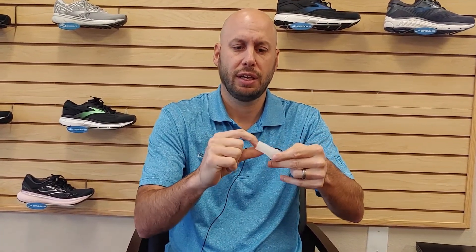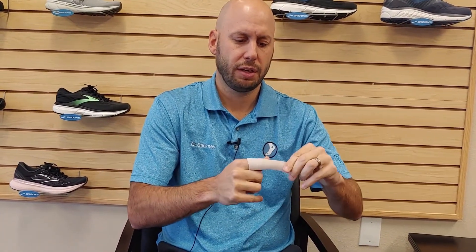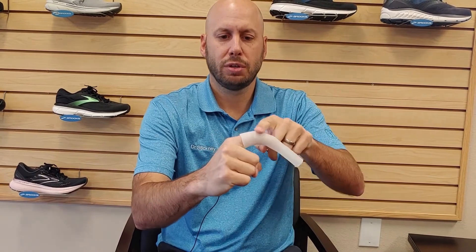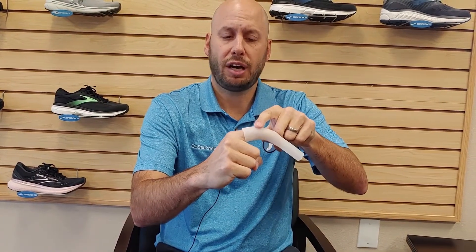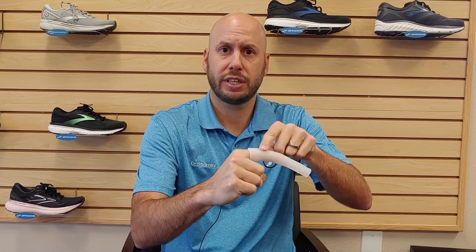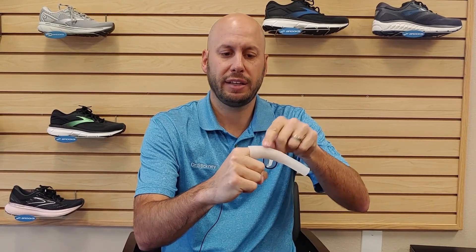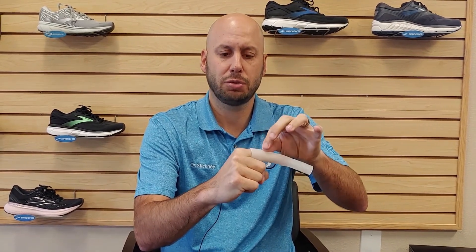One thing that you can do for this is take the toe sleeve, cut it to the appropriate length, and then just slide that toe sleeve right over the toe like that. This is padded on top, so if there's any kind of shoe rubbing or any kind of object rubbing, that's going to take the friction off and put it on the silicone. It's also going to pad the area and give you a little space in between there so the toe doesn't rub as bad.